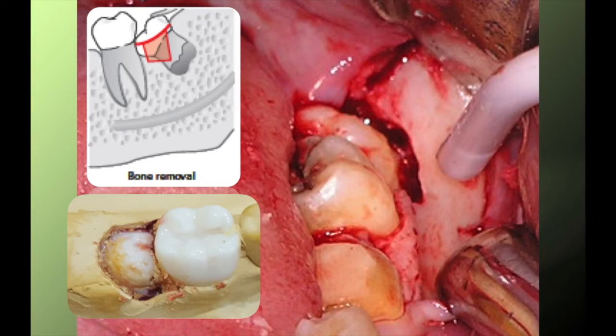On a personal note, depending on the depth and angulation, I would like to see a landmark like the buccal groove on this benchwork simulated horizontal impacted tooth. Looking at an anatomical landmark helps me determine the extent of my bone removal intraoperatively, since planning on the radiograph is hugely different compared to when I implement it inside the oral cavity.